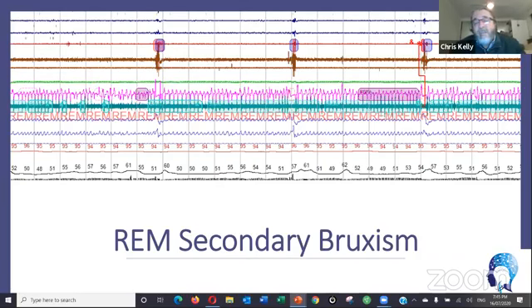That is real bruxism in terms of what the ICSD terms bruxism. That's why I like that screen, because I'm looking for it on every sleep test, and when I see it, I make a point of telling you this is sleep bruxism. There'll often be a couple of those shots. It's really good for dentists to realize that the reports they may be getting back from classical sleep studies really aren't reporting on what dentists look for.